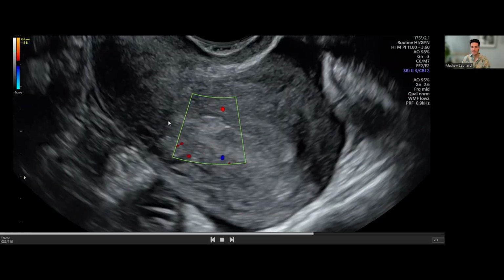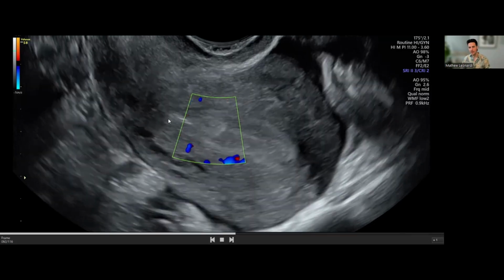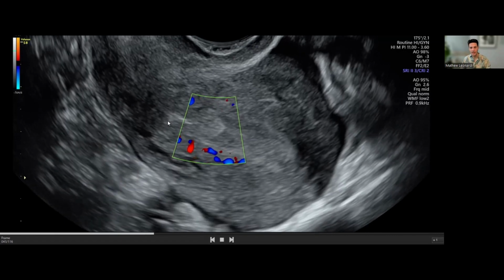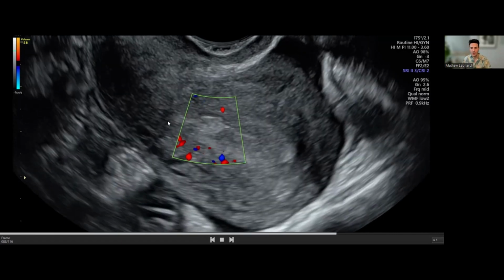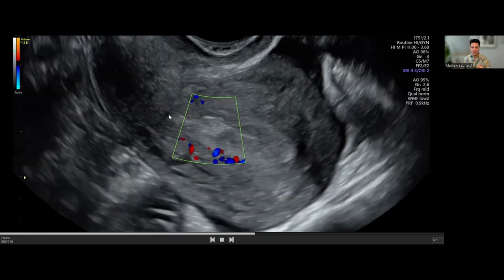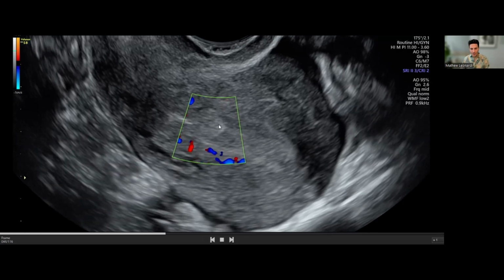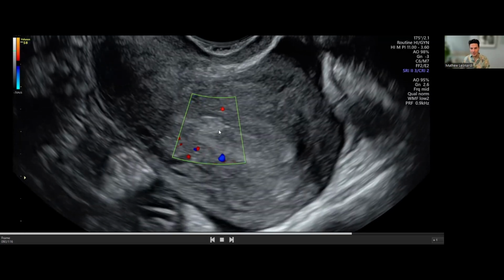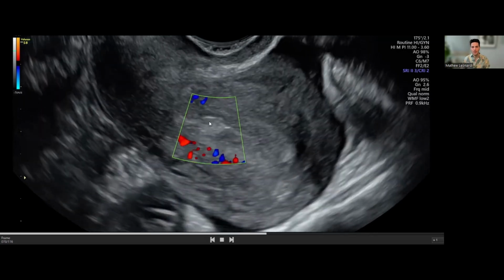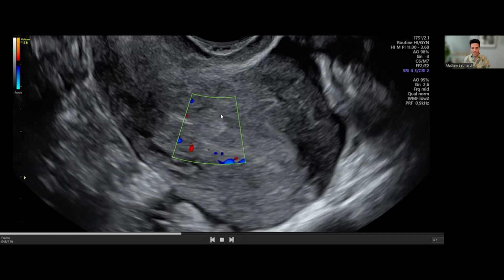One of the interesting things is that around that mid-cycle time, because of a goal of the uterus to move sperm to egg, there is myometrial contractility. And you can use that to your advantage because something within the cavity might actually move. And you are seeing that very clearly right here. You see this polyp is actually moving with the surrounding endometrium due to the myometrial contractility.